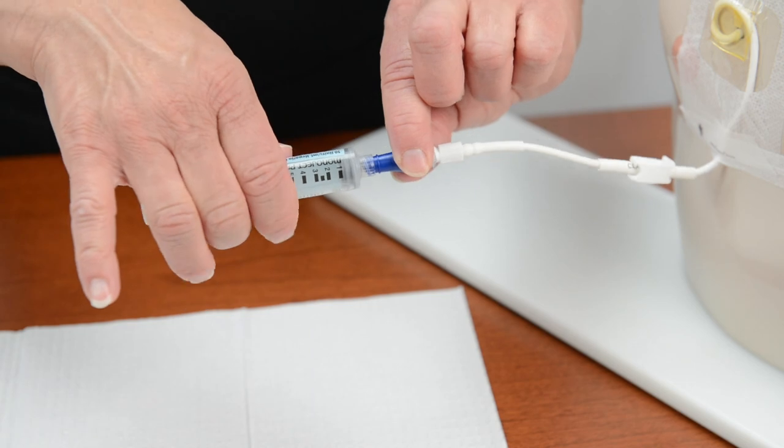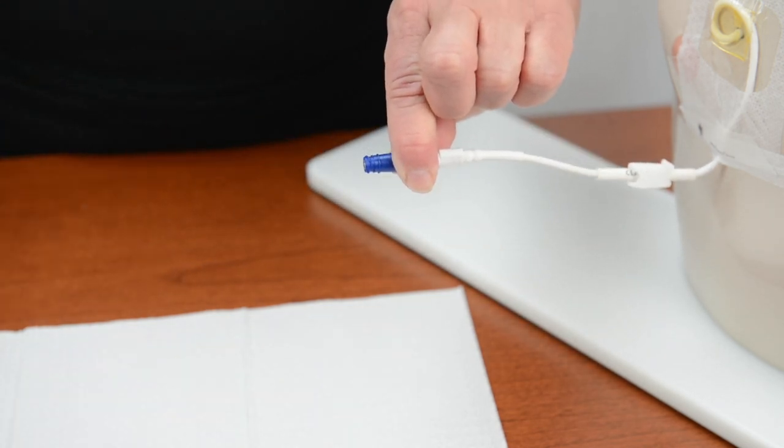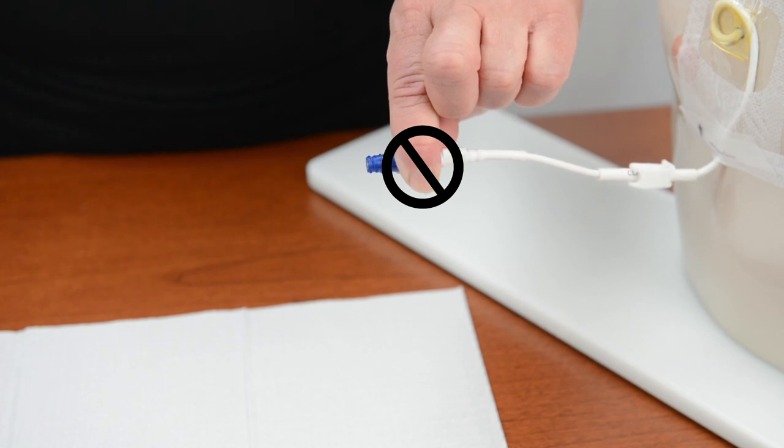Hold on to the needleless connector. Remove the empty syringe from the connector and place it into the trash. Do not remove the connector from the IV catheter.